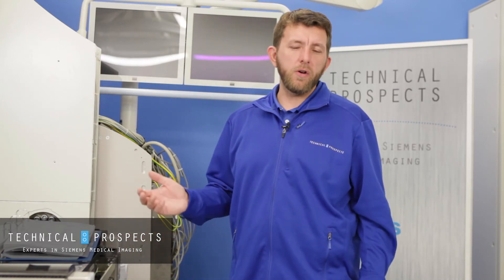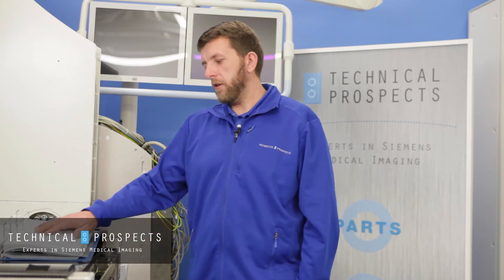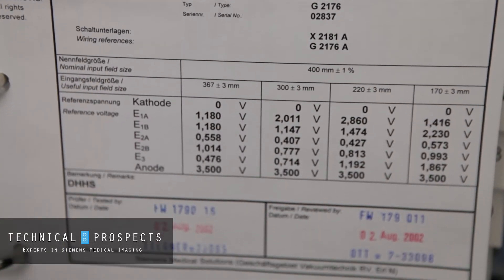Hello again, it's Kevin here at Technical Prospects. Today we're going to talk about using your test certificate for your II on your Siemens fluoroscopy systems. The first thing you need to do when replacing a power supply or the entire image intensifier is go into your system manual and get out your test certificate. The test certificate tells you what the calibrated values are, specific to that II by serial number.